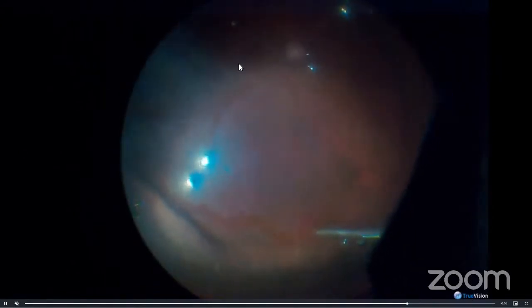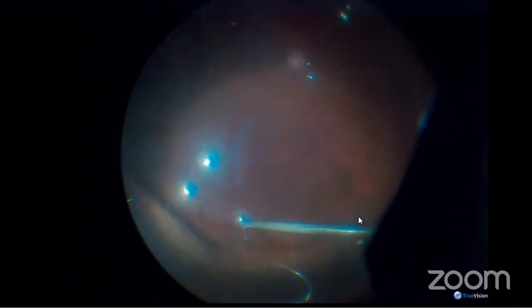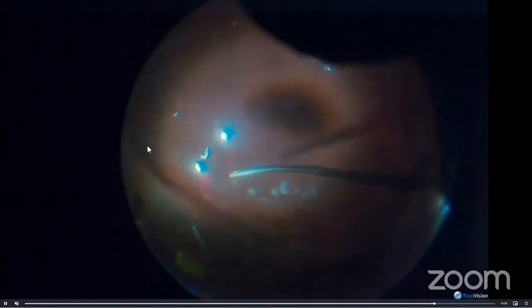From here you can see very obviously that the gapping is no longer there as he dries up the subretinal fluid with the aid of the heavy liquid. After the fluid is completely drained, you can proceed with the endolaser to sear it off.